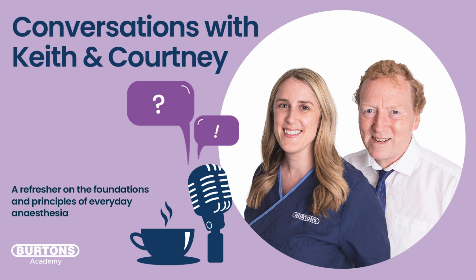So we need that. We need something, don't we, to back up what that pulse ox is saying. And the first response is, as you said, reposition, because if we get a repeated value, then you tend to start to believe it, and then we'd work on that.